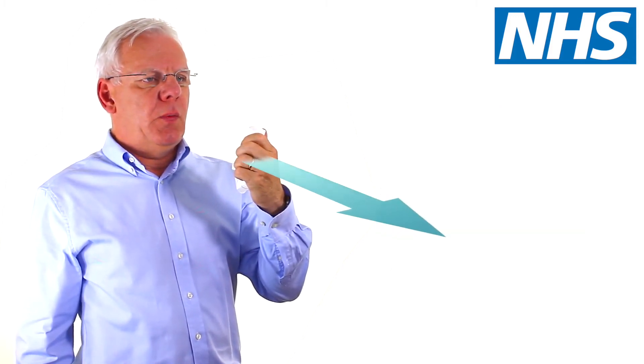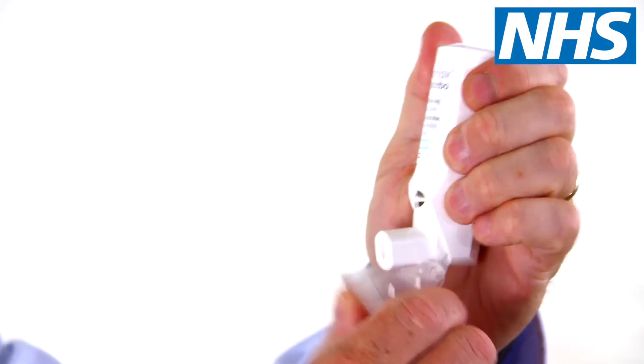Remove the inhaler from your mouth while holding your breath for up to 10 seconds, or for as long as is comfortable. Now breathe out slowly and gently, away from the mouthpiece. Close the mouthpiece until it clicks in place.